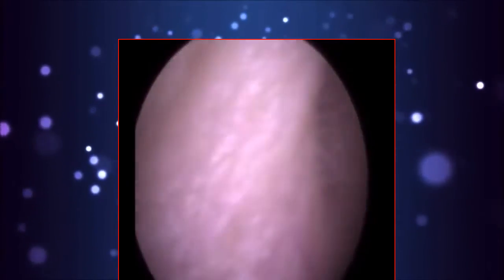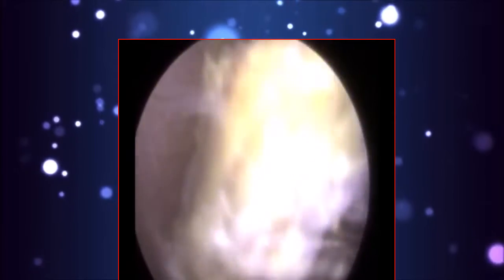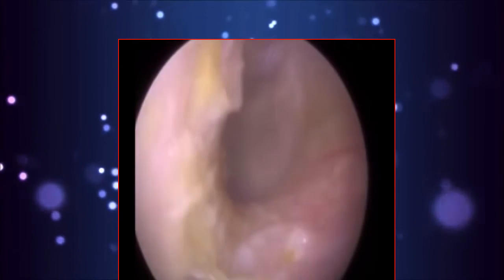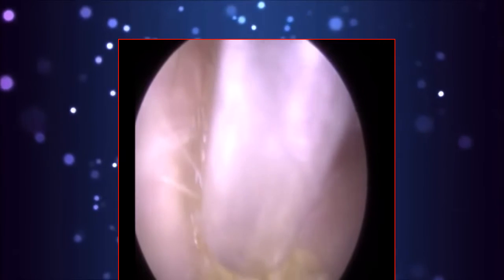Again, he's got a lot of dead keratin, you can see that, the white coating. So I've just got him with some forceps. There was enough give. This plug wasn't too soft, because otherwise we'll just be dissecting it. It came out in a big chunk. Just some dead keratin again. Just going to mop up near the entrance.